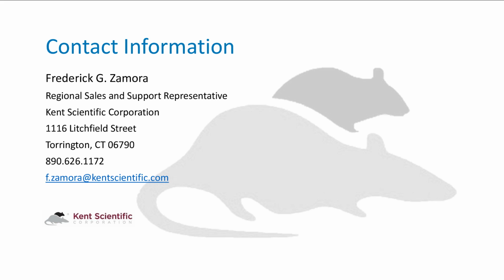Perfect. Okay, next question here is, if you get a SomnoFlow, do you have to purchase the RightTemp device separately? Correct. Hello, Sophie. Yes, if you do get the SomnoFlow, you do have to purchase the RightTemp device separately. The SomnoFlow was created as a result of some of our customers saying that they love the SomnoSuite, but they want just the anesthesia system on its own. So unfortunately, you do have to purchase the RightTemp device separately.